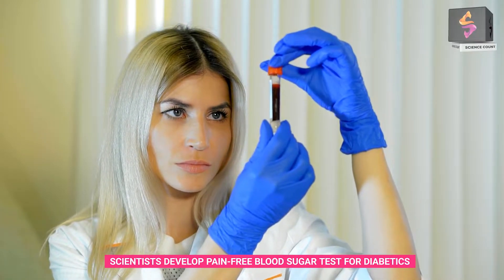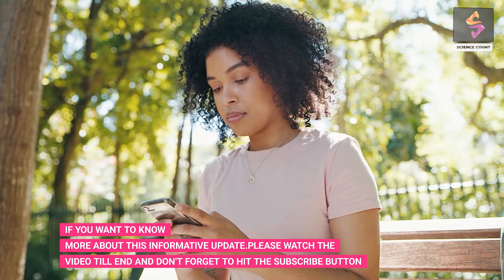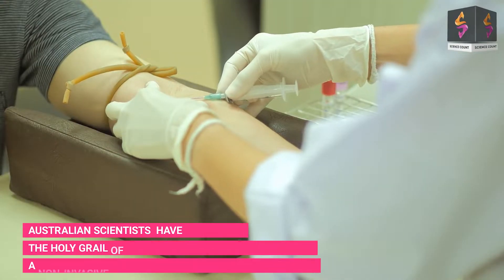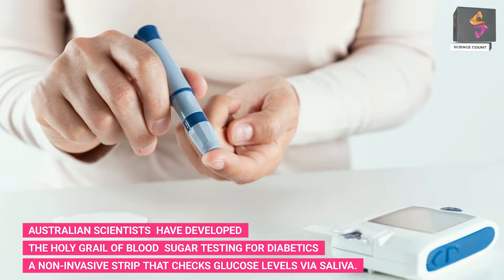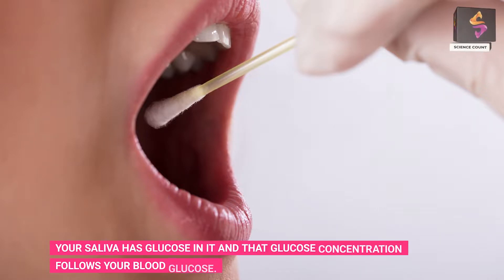Australian scientists have developed what could be the holy grail of blood sugar testing for diabetics: a non-invasive strip that checks glucose levels via saliva. Your saliva has glucose in it, and that glucose concentration follows your blood glucose.